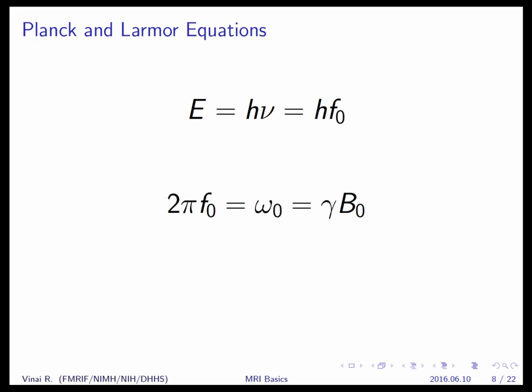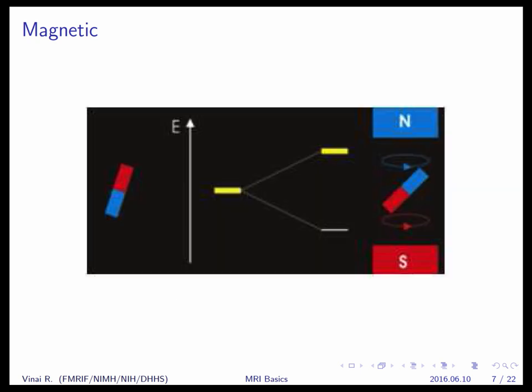I apologize in advance for not being able to follow it properly, but in your previous slides, when you said the energy gap, did you mean the energy gap of the electron with the neighboring? No, this is purely an energy state of the nucleus. Just like how electrons in different spin orbitals have different energies, the nucleus has a similar property. So it's the difference between it spinning one way versus the other. Same concept, but a different particle. So this is in the nucleus, not in the orbital bands.